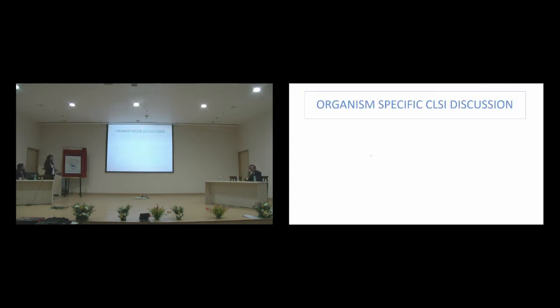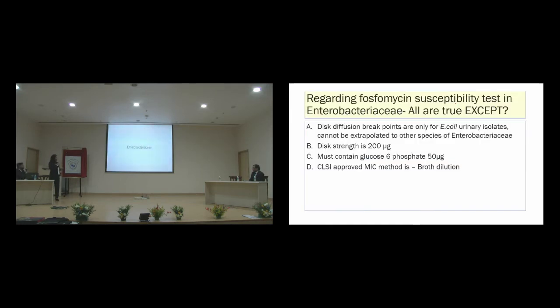You know why? It is inactivated by the surfactant. Okay, so next, coming to organism specific discussion. First is Enterobacteriaceae. Please answer this. Regarding fosfomycin susceptibility testing in Enterobacteriaceae, all of the following are true except which of these options?